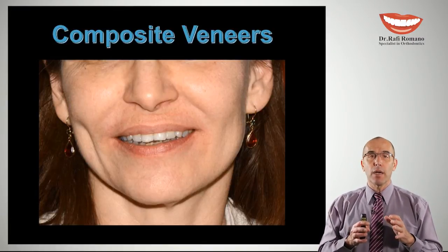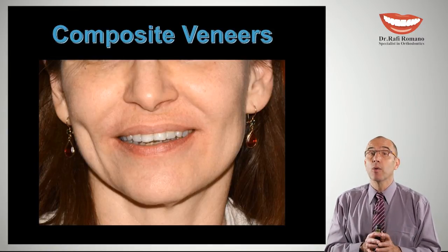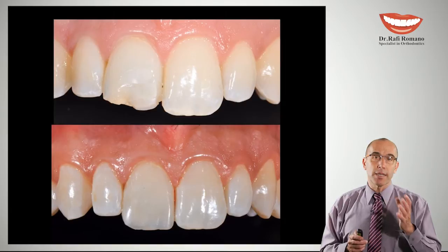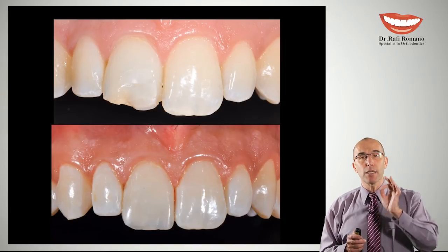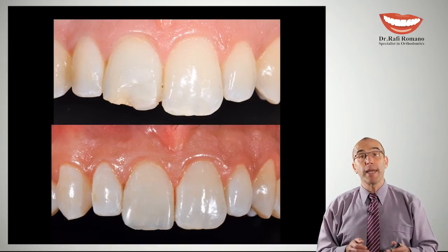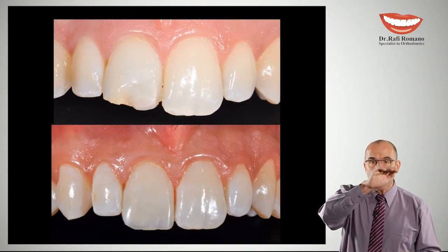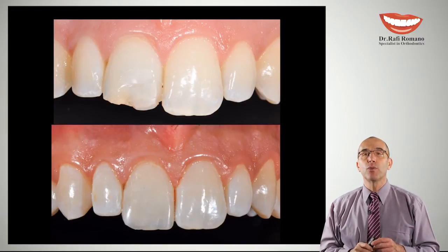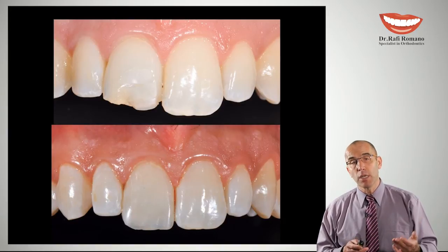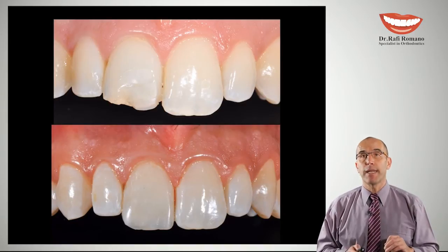Now, another thing that should be discussed now is if and when we want to do some composite veneers. For these abraded centrals, this is an example of another patient, we can create a nice composite veneer where this abrasion can be restored. Of course, we can also take polishing discs and just shorten the teeth according to the neighboring ones. But that's a decision that should be made together with the patient and the prosthodontist, to decide if and when we want to do these little aesthetic changes.